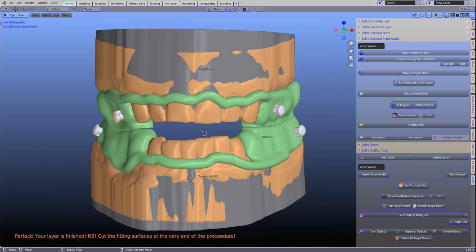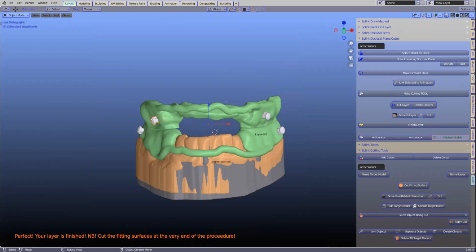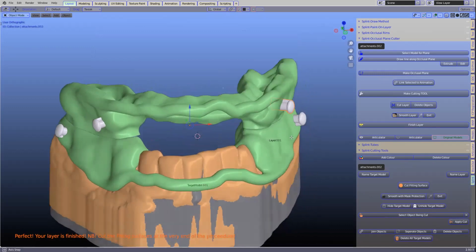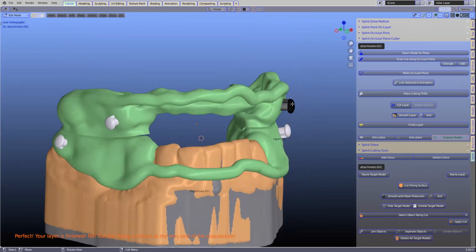Hey, Wolf. That's right. Can you just explain to everybody the reason why those attachments are the way they are, designed like that with the upper ledge? Oh, Wolf, you just explain that. Maybe this was your idea.